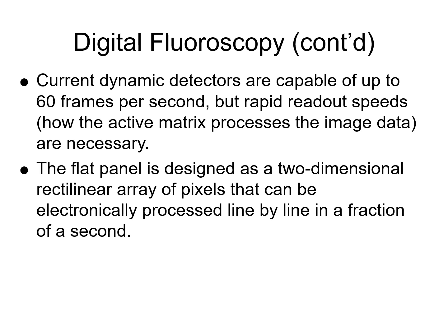And so once you get past 30 frames per second, 30 individual images, so image A, and then a fraction of a second later, now it's image B, and there's a slight change, and now it's image C, and there's a slight change, and the images are being swapped out on the monitor so fast that it looks like motion to you. It looks like fluid motion to you. It looks like dynamic, real-time, real live movement, okay?